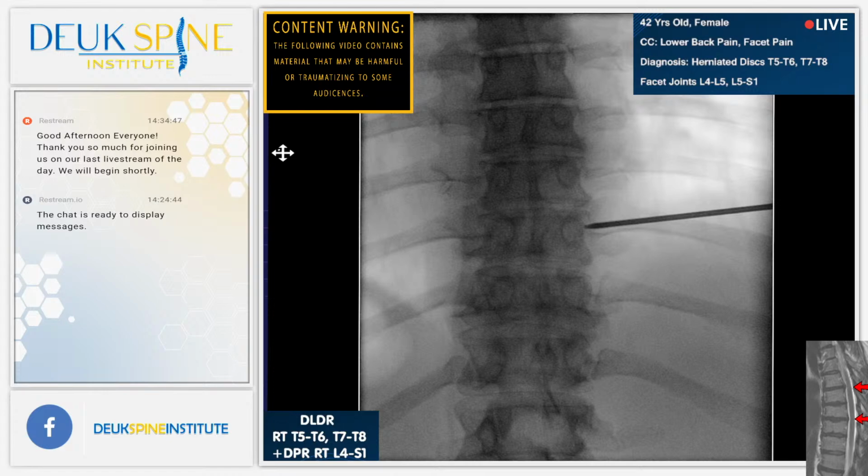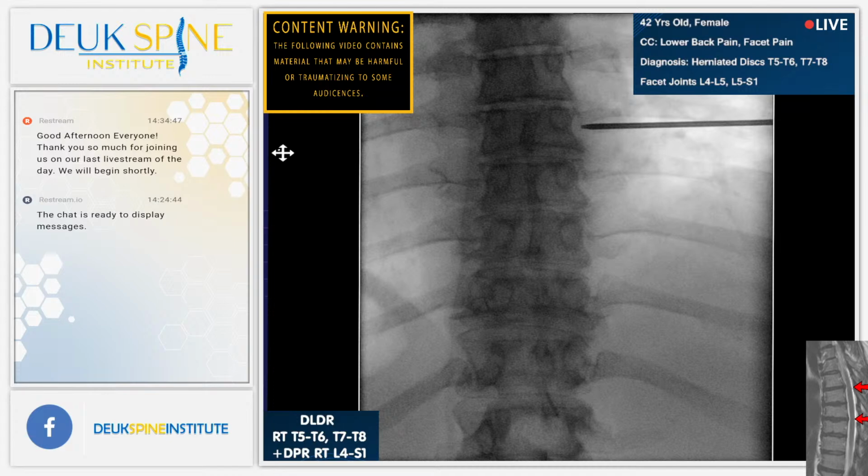Interesting. And we need to make our way up to 7, 8. Nine, 8. Go ahead. That should be 8 right there. So 12, 11, 10, 9, 8.